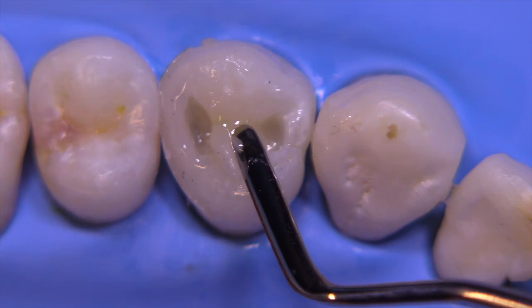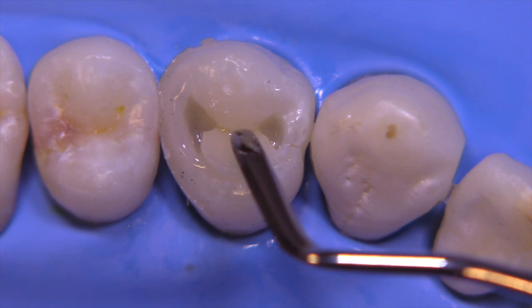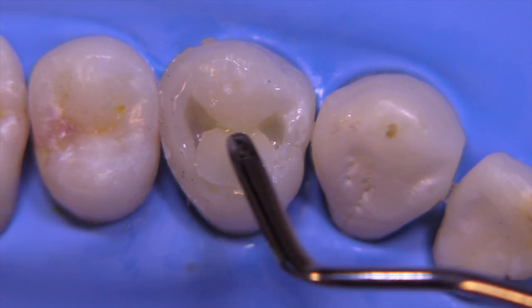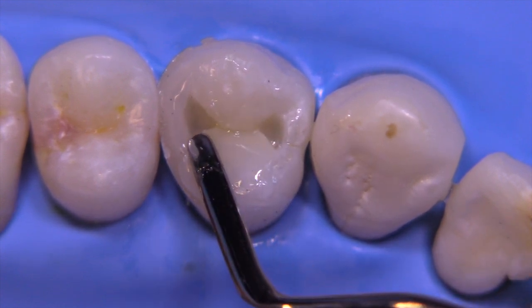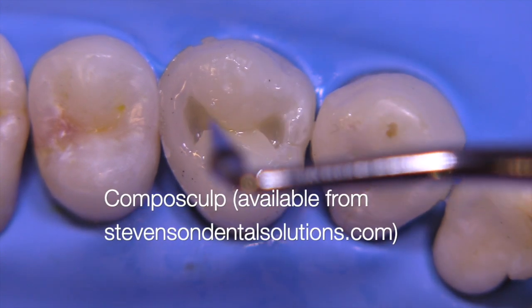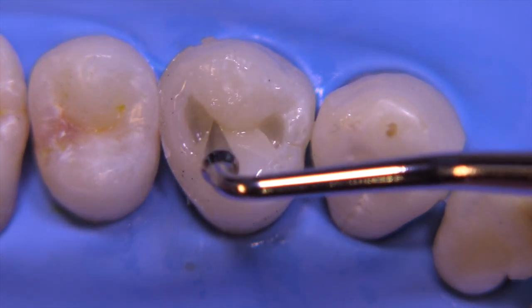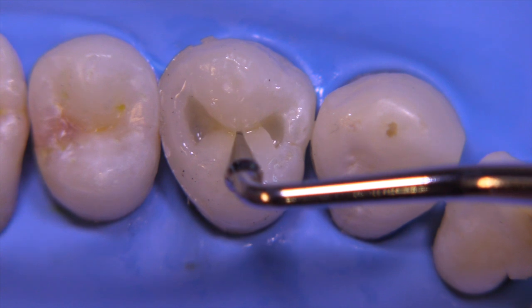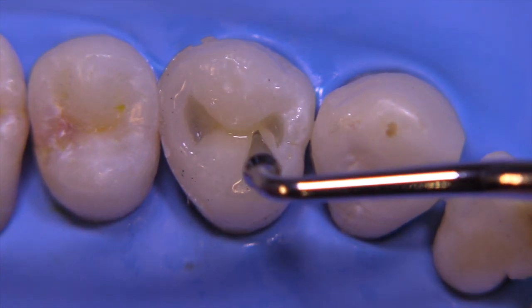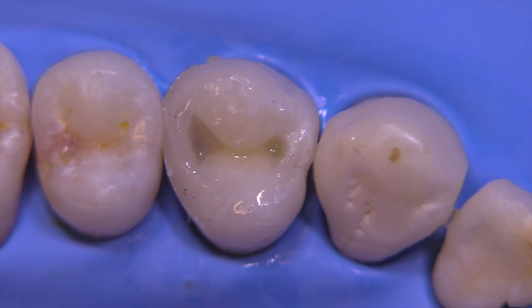Now we're going to start to build up the composite, and I'm going to build this under-contoured — meaning the outer surface will be below the final contour we want to achieve. I'm going to utilize instruments called the Compo Sculpt instruments, which I have available at my website in the store area if you're interested in a set. They've got a lot of different tips, angles, and shapes that can really help you out.